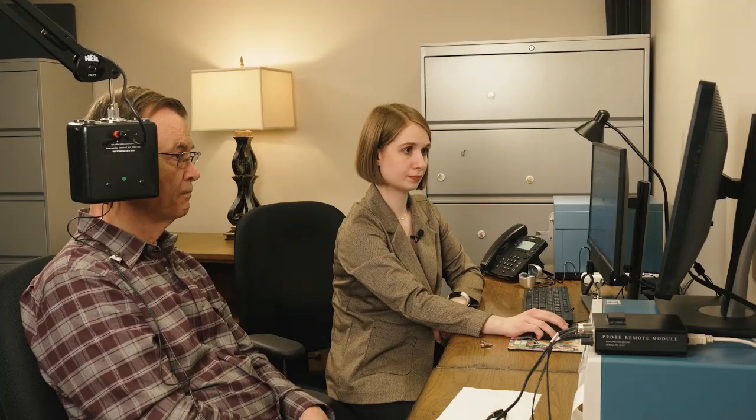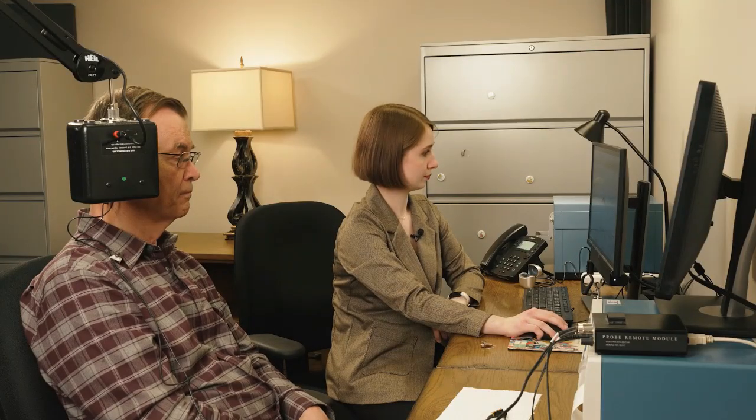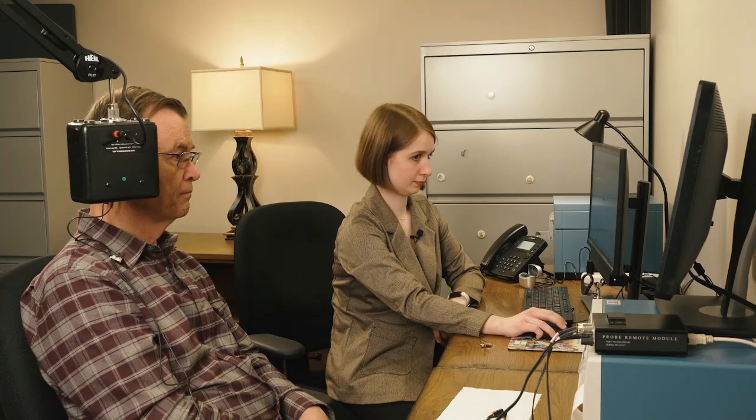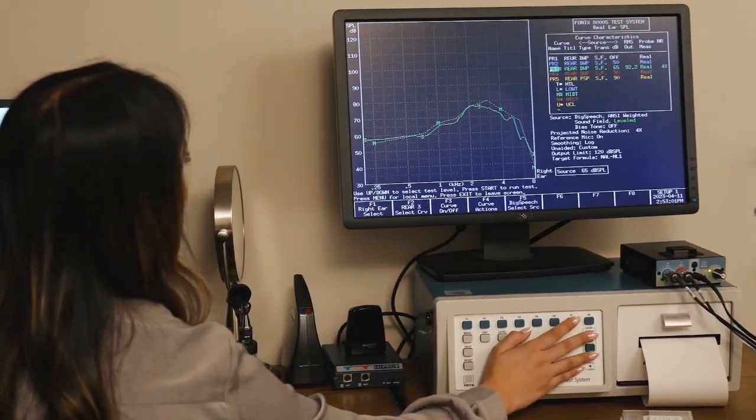For new users, we will often reduce the overall volume softer to a 70 or 80% correction, and then slowly increase the volume as the patient adjusts to the new loudness. We can also do a little subjective fine-tuning around our prescriptive target for the patient preferences.